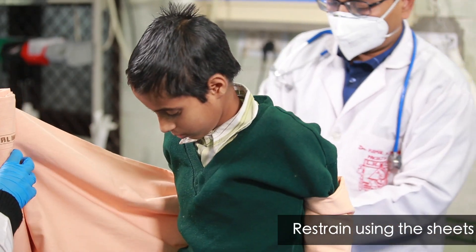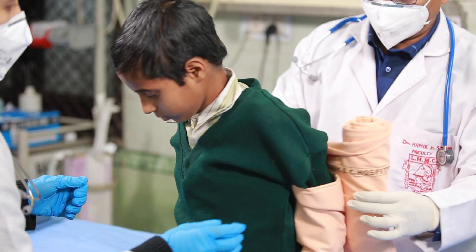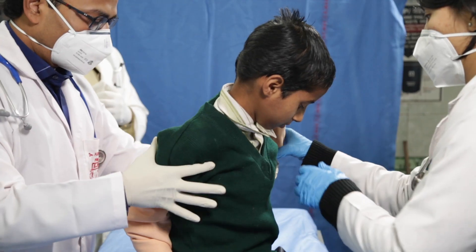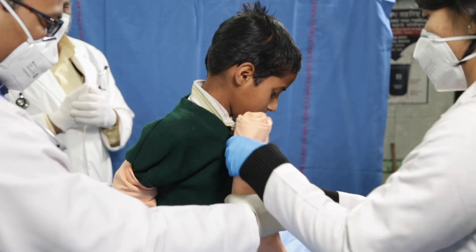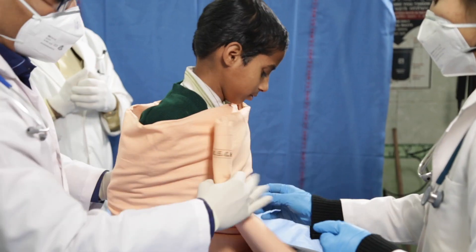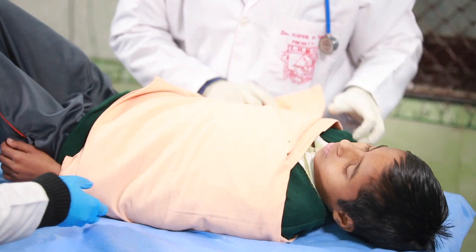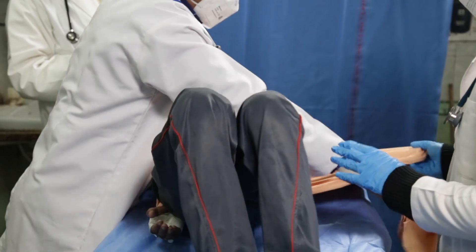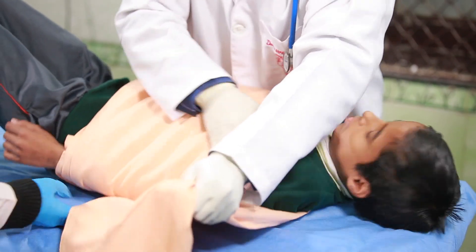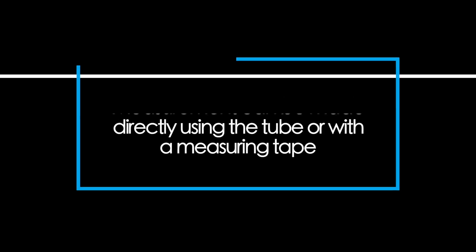Additional instruments include a face mask, sterile gauze, and a measuring tape. Place the patient in a supine position and restrain using long folded sheets. One end of the folded sheet is pulled over the back of the child, looping through both arms as shown. The other end is rolled over the arms and wrapped around the child, moving from back to front and then to the back. The lower end of the sheet should reach the wrist of the patient for effective restraint.